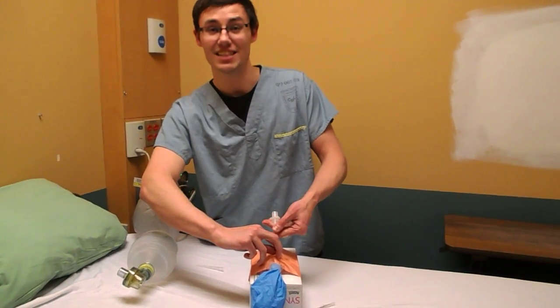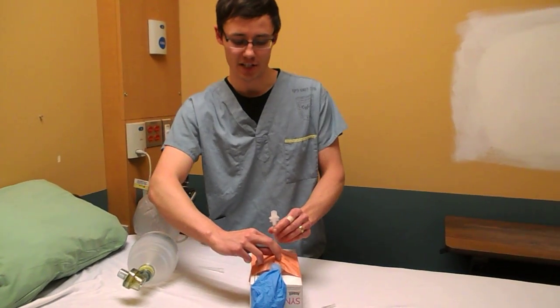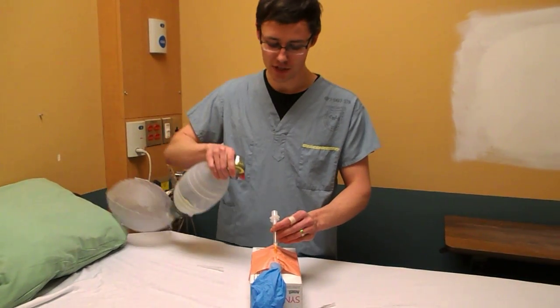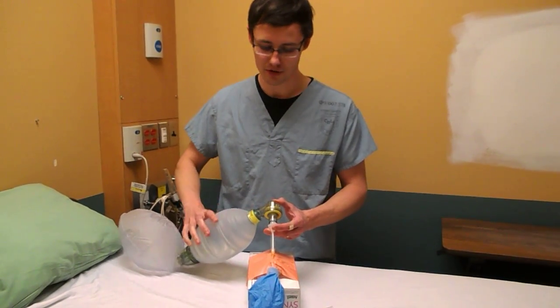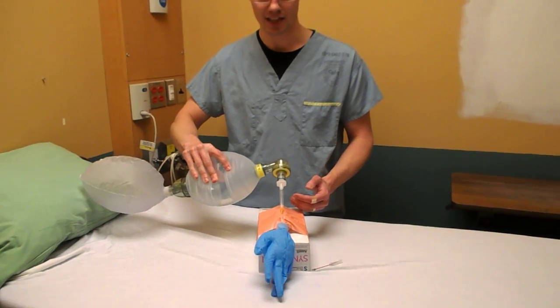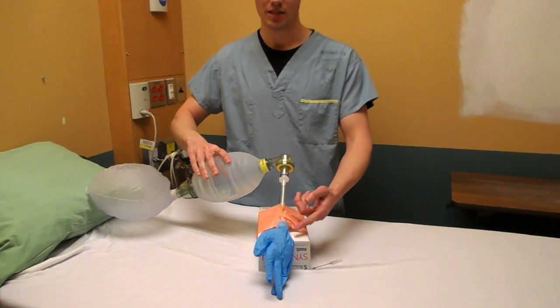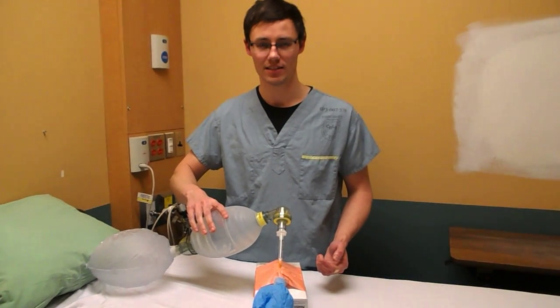At this point, you're going to get somebody to hold this and make it secure, or you're going to tie it down. Now, you attach your syringe with your ET tube adapter. You can bag through this. You're going to make quite a bit of airway resistance, as you can imagine from the dead space, but you can see it's doing a fine job of inflating a lung.